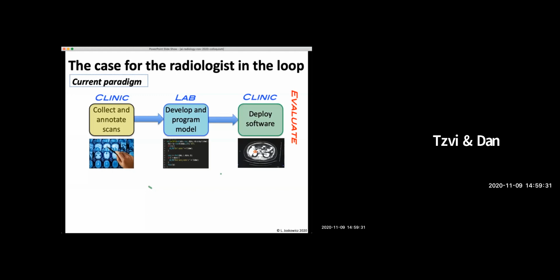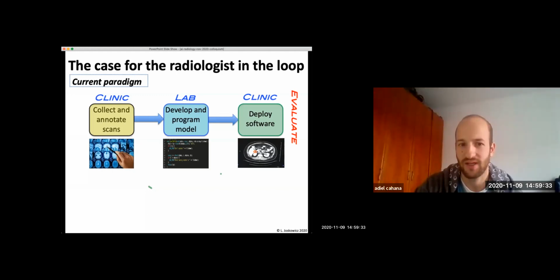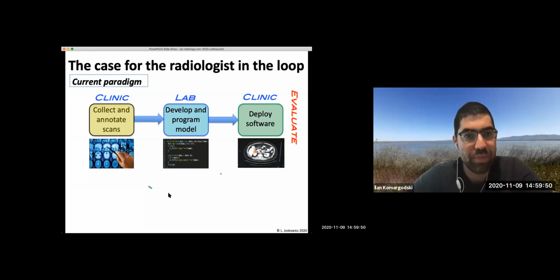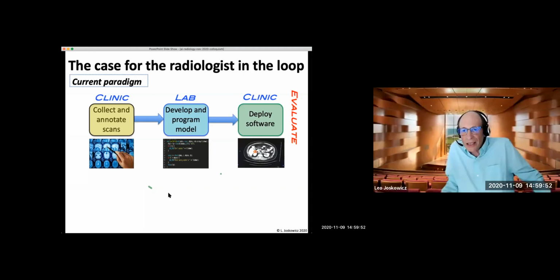Is there a paradigm to do some unsupervised feature extraction on this test? Yes, this has been tried. It works for some amount of cases, but it's been shown very clearly that it's better to go with a few annotated cases and add to that.